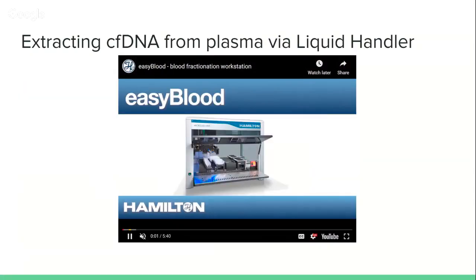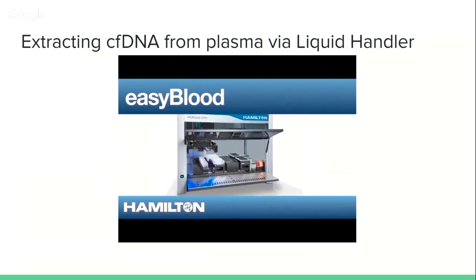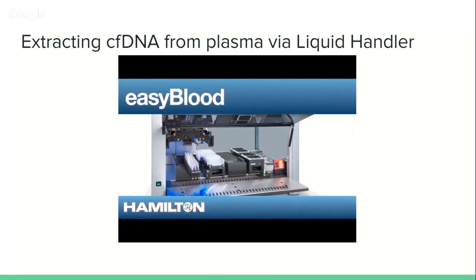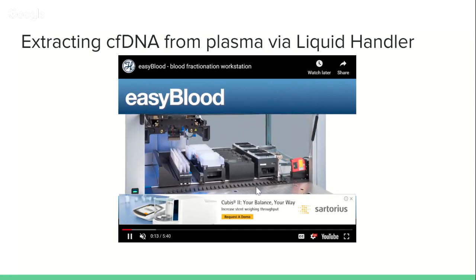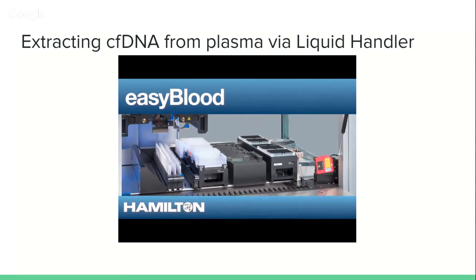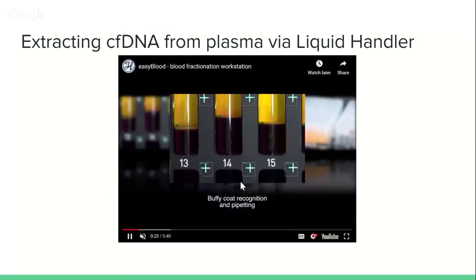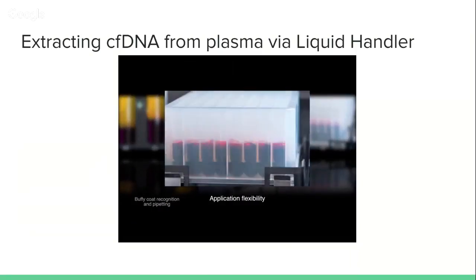And so the first step is to extract the DNA from them. And let's say you've generated a batch here that is balanced by the different factors you want to account for: age, gender, provider, clinical position, etc. You can now take each of these batches and extract the DNA from the plasma into another tube that will contain the cfDNA. This is an example for cfDNA. It could be for something else.